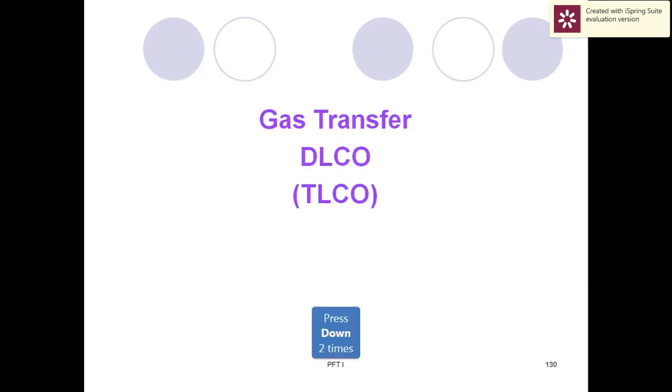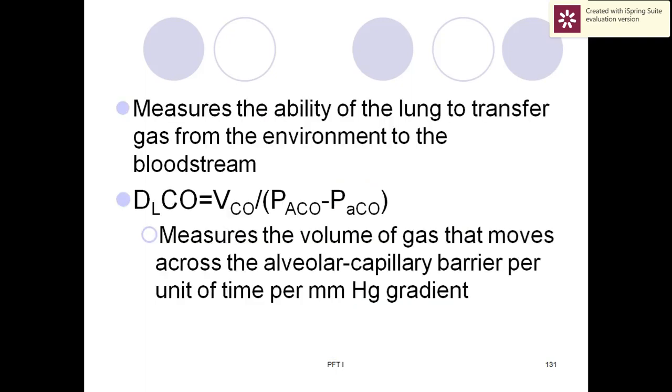Gas transfer. TLCO measures the ability of the lung to transfer gas from the environment to the bloodstream.